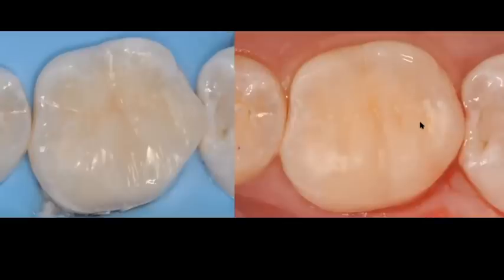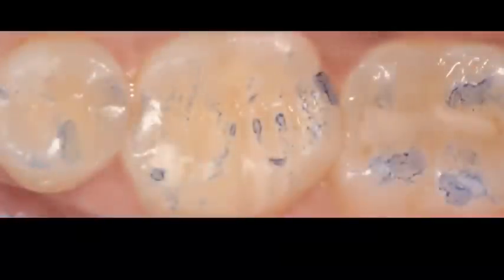Now, that being said, at the beginning, if you've never done this technique before, yes, it's going to be a little bit, it's like everything in dentistry. We train, we learn, we get used to things, and then it just becomes second nature. For me now, it's second nature because I've been doing this for a long time. And this is the only way I restore posterior teeth, using these techniques. But again, it may take you a little bit more time at the beginning, but it's going to reduce the amount of time that you spend just working and trying to get this tooth to look like a tooth if you use horizontal layering techniques.